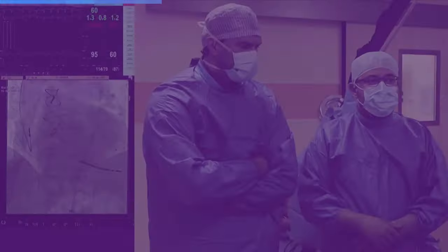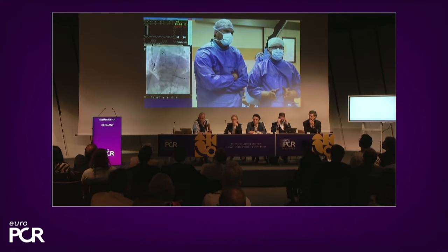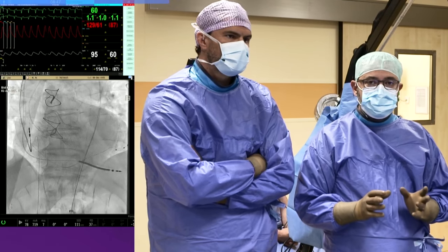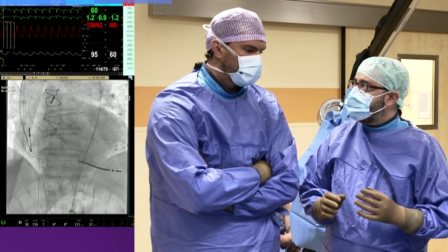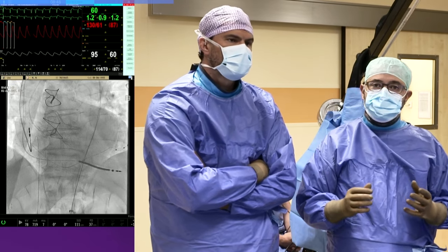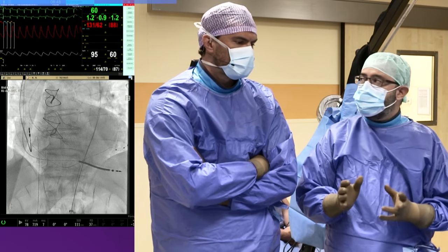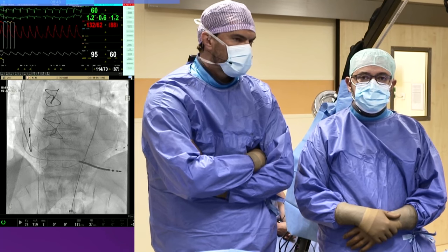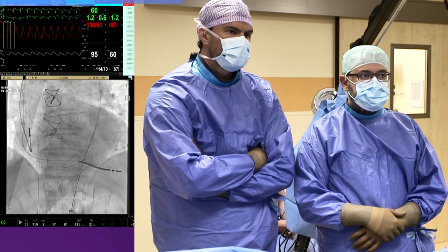Thank you very much. We have considered what the CT told us concerning how to look at the CoreValve without parallax, which is, I think, extremely important here. So we're not focusing on the native anatomy, we're focusing on the CoreValve device in order to see it without any parallax and to identify these different nodes we discussed, in order to implant the valve at the desired position, which, as we said, will be between node 6 and maybe even going up to node 7. So we want to pin the leaflets because we think that there is no problem, definitely not with the left, which is occluded, and also with the right concerning this particular anatomy.